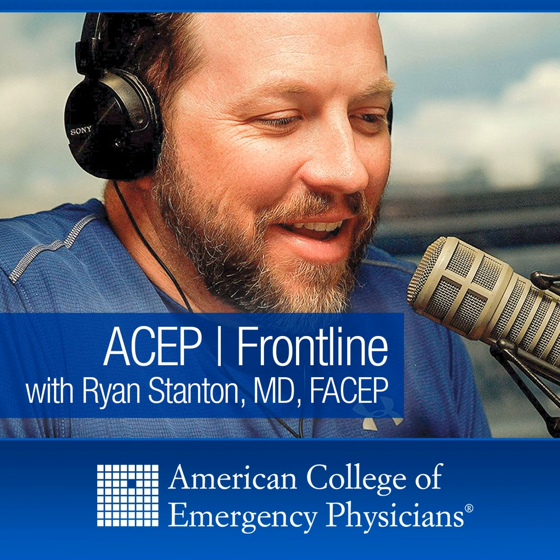Yeah. Because Doppler flow is such a better way of evaluating whether there's something there, because so many times when somebody does or does not feel a pulse, it is or is not there in just the opposite way. But that little puff of yellow-red. And we have to understand, too, that anything that we're talking about right now isn't achievable on 100% of patients. But looking at the femoral region to see if you're getting decent circulation during the actual compression.